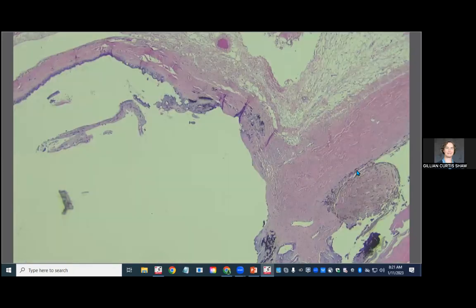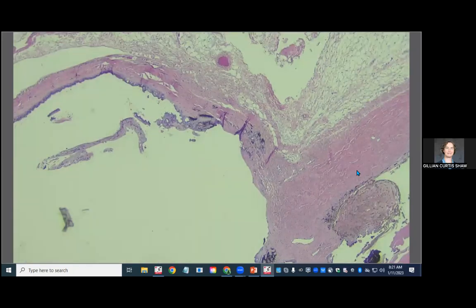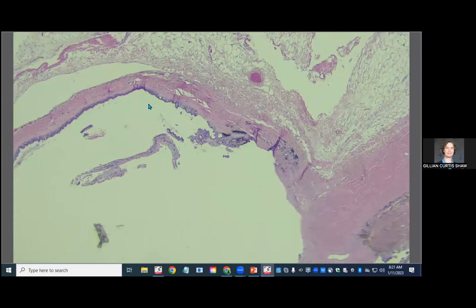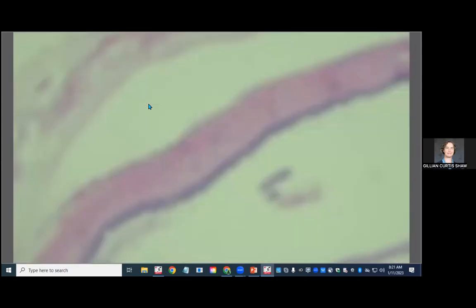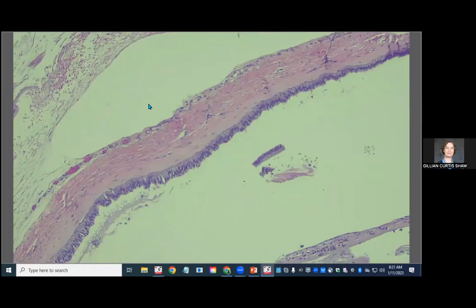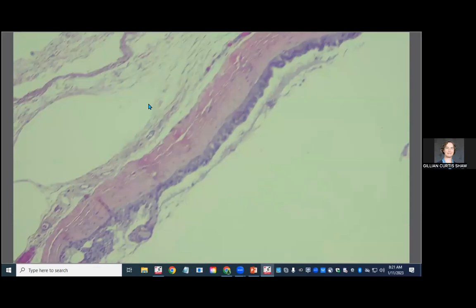And then there's barely anything that's uveal at all. We just have this outpouching of the globe. The more normal scleral collagen seems to end, and we have this big outpouching that's basically just lined by a single layer of neuroepithelium. So it is reminiscent of ciliary body epithelium, but it's just this single layer of neuroepithelial-like tissue. And we follow it along.